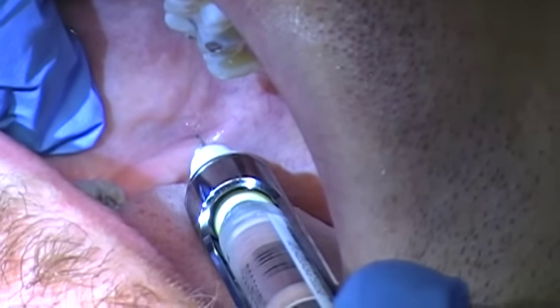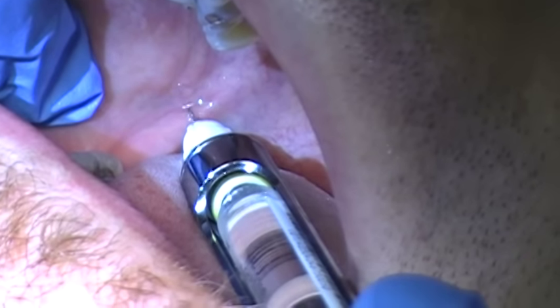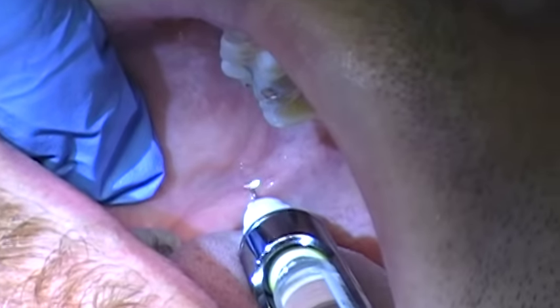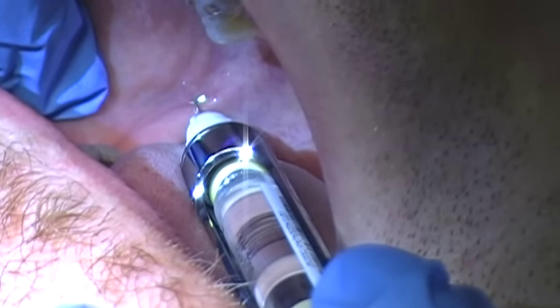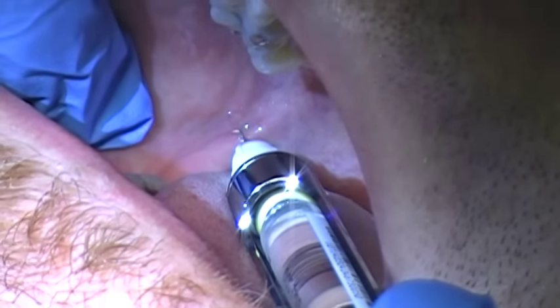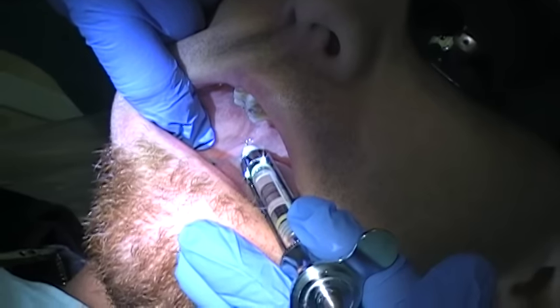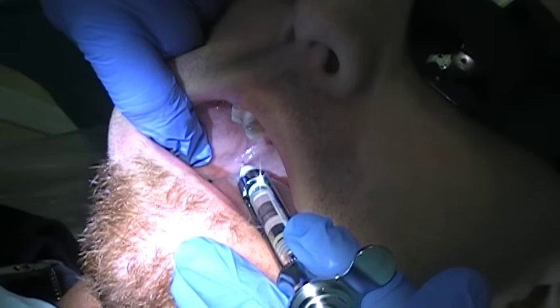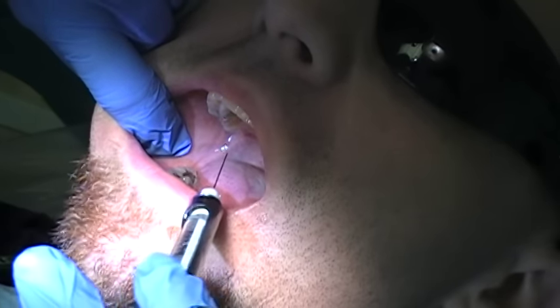You want to be about two thirds to three fourths of the way in and contact bone, gently let off the bone, aspirate — it's negative — give comfort drops, wait five seconds, and then deposit. I'm going to stop short of the whole cartridge so he's not too numb, but I'm going to come right directly.